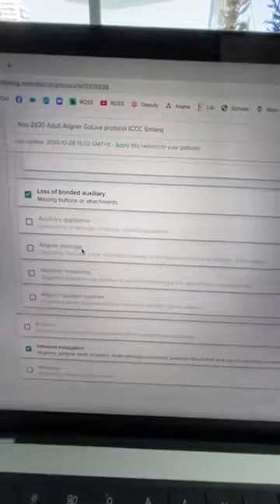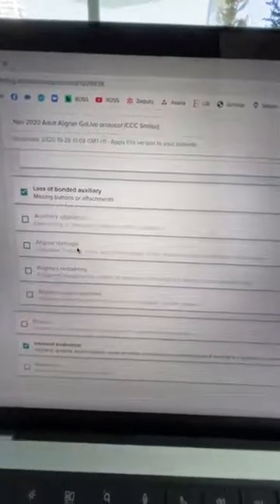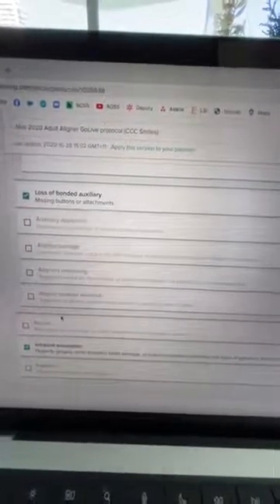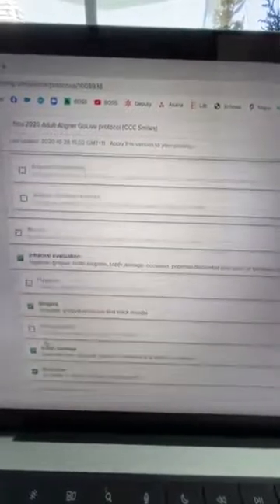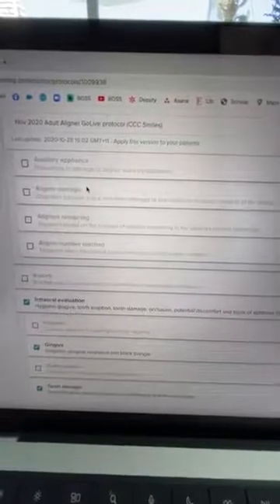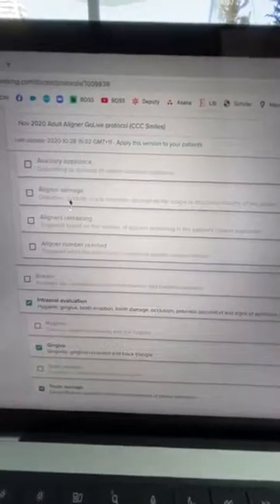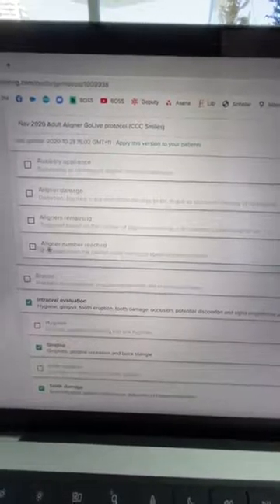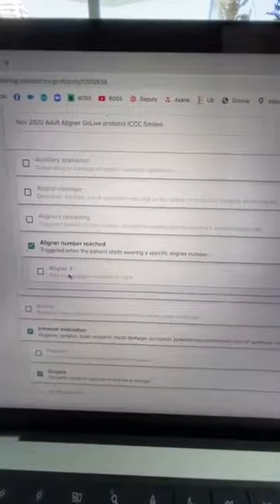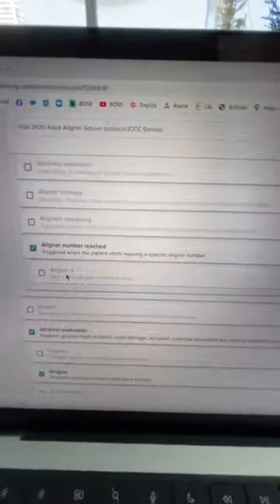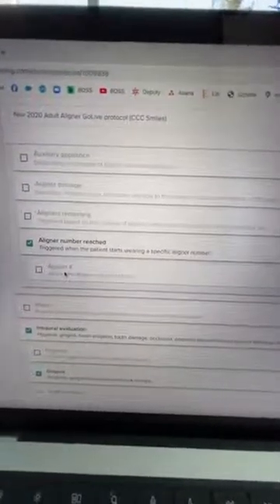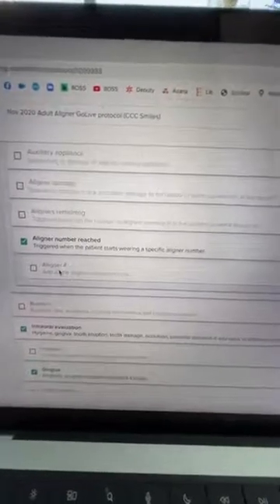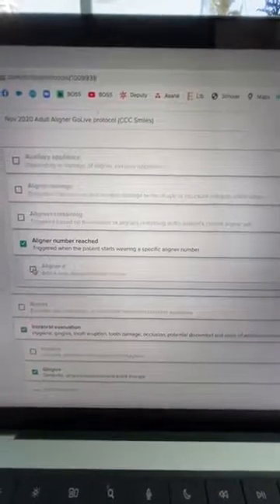These are all the different protocols you can set. For example, what if the aligner was damaged? Do I actually want to track that? You can also ask for an alert when a certain aligner number has reached for that patient. So every 14 aligners maybe you want to be alerted to book them an appointment, or every 12 aligners. You can ask dental monitoring to give you an alert that at aligner 12, please advise my team to book them an appointment.